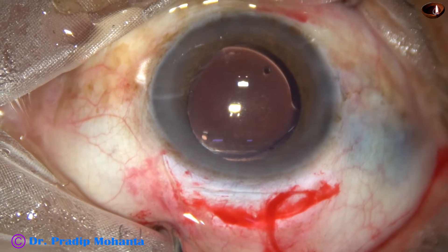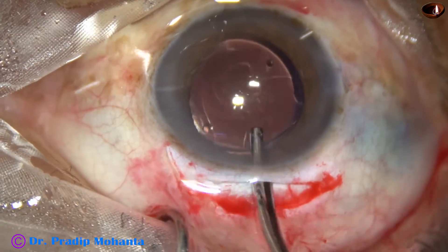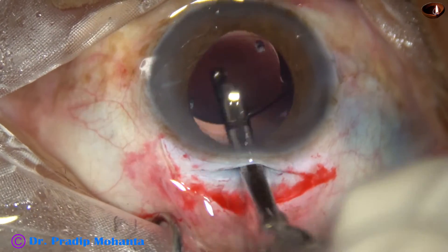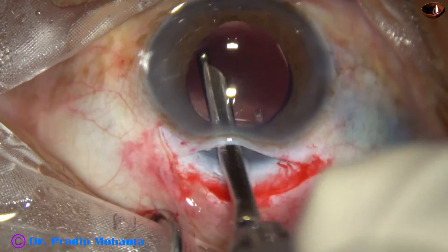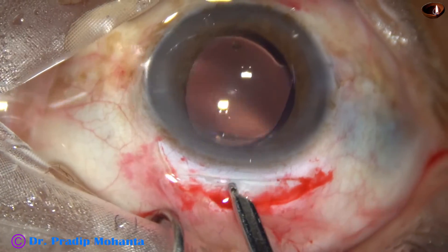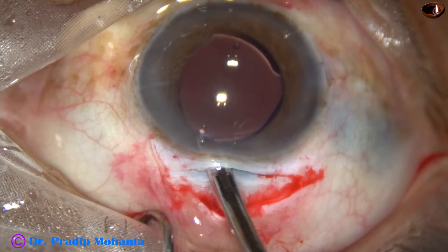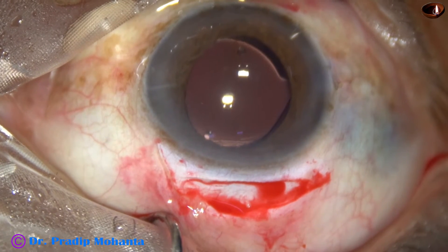Our surgery is done but we have important things remaining. The most critical step is to remove the viscoelastic substance thoroughly. We should not leave any viscoelastic believing it will get absorbed through the trabecular meshwork — yes, it may get absorbed, but it will cause raised intraocular pressure for a few days. In those few days the patient will have pain, cannot see clearly, and there will be steamy corneal edema. If we dedicate just one or two extra minutes to removing the viscoelastic, the patient will have clear cornea, normal intraocular pressure, and will bless you.